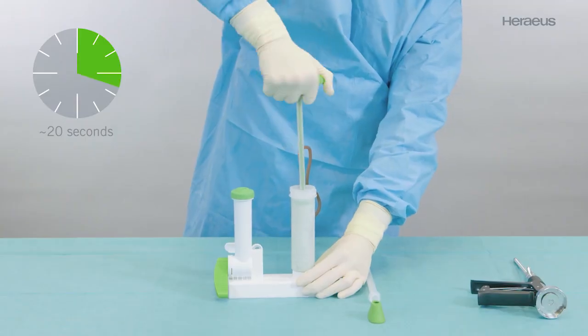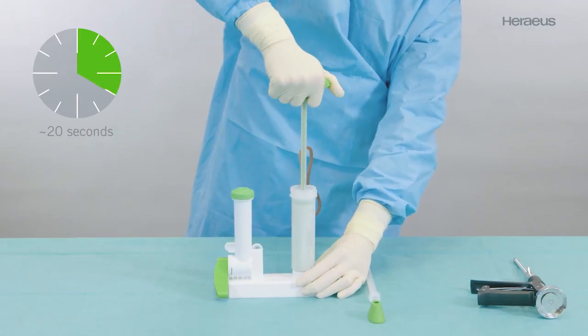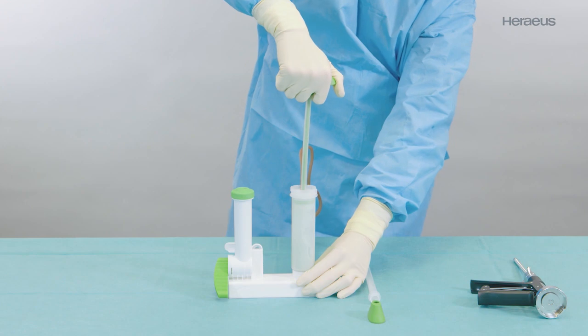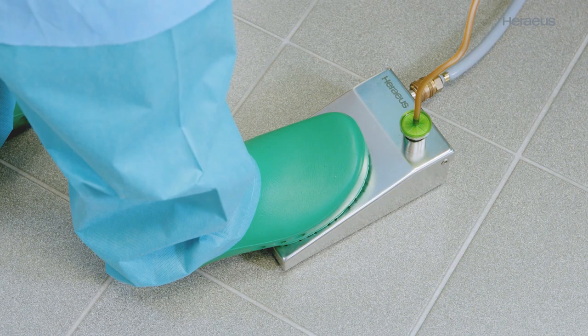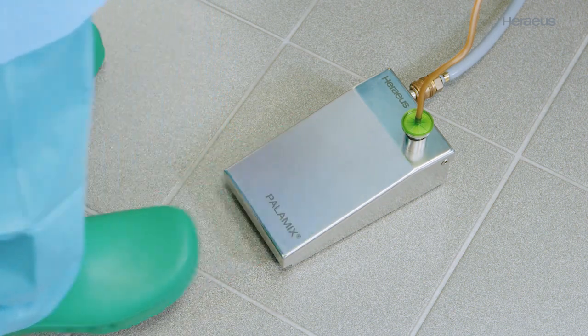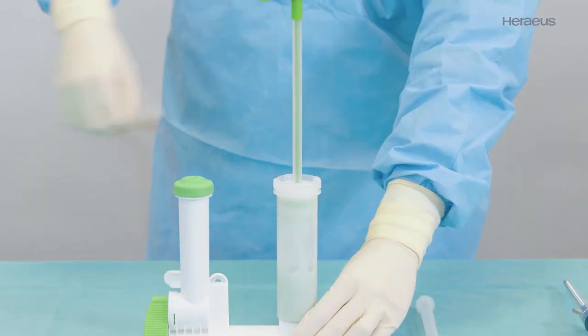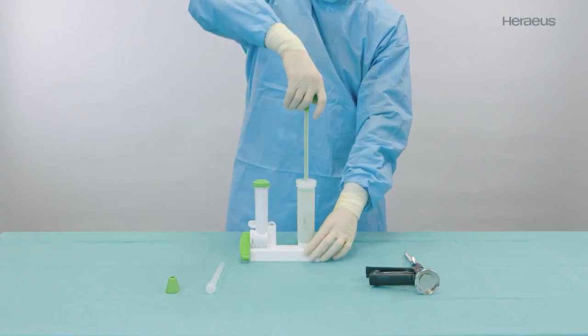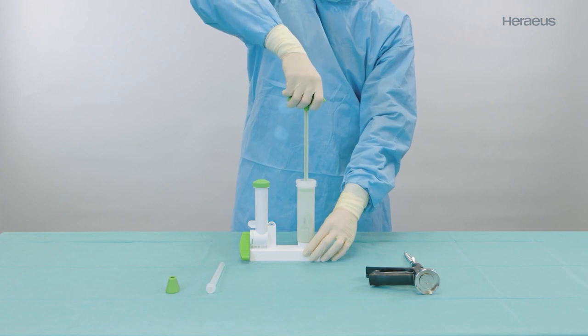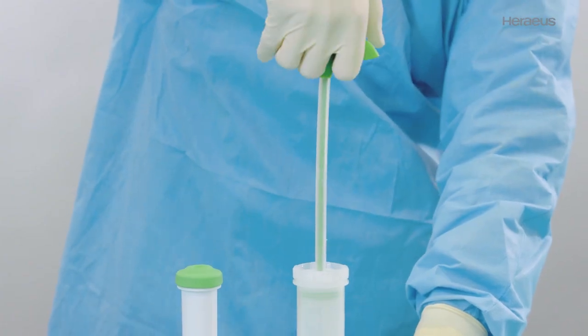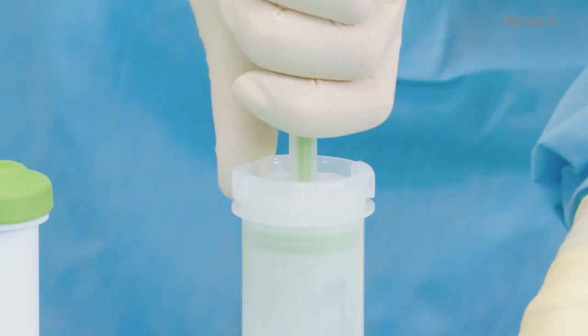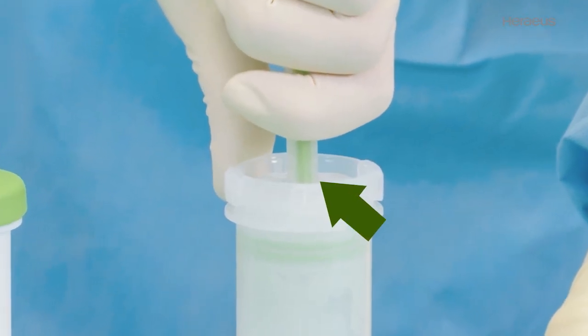Pull up the mixing rod until it stops and turn it to the right and left briefly. Switch off the vacuum pump and remove the vacuum hose from the mixing head. Ensure that the mixing rod is still pulled up to the stop. Break the mixing rod off the mixing head at the predetermined breaking point.